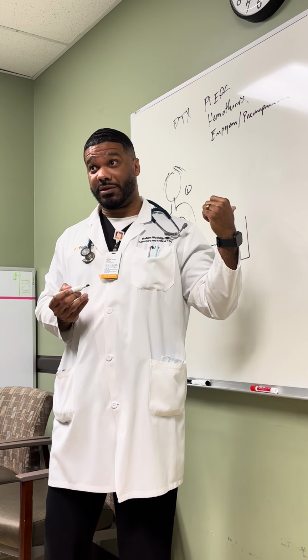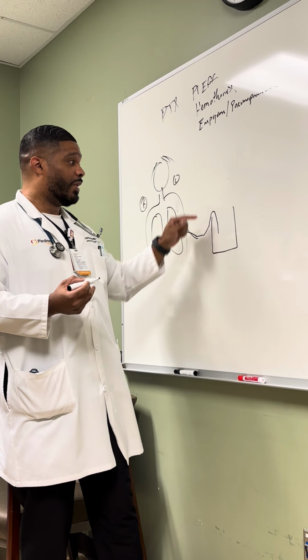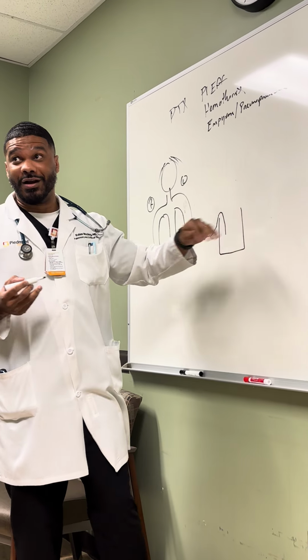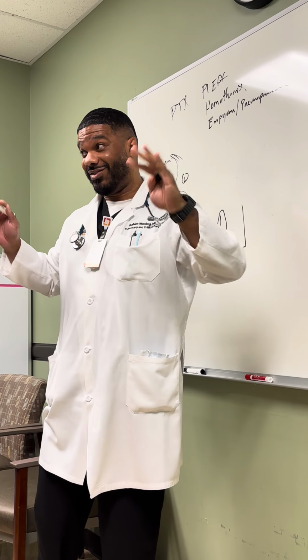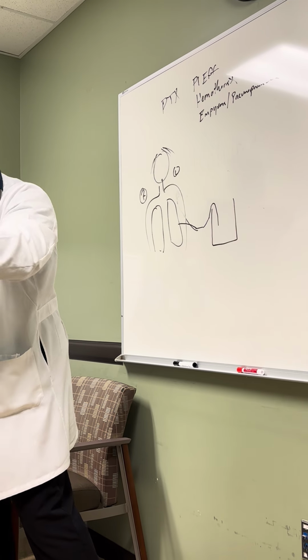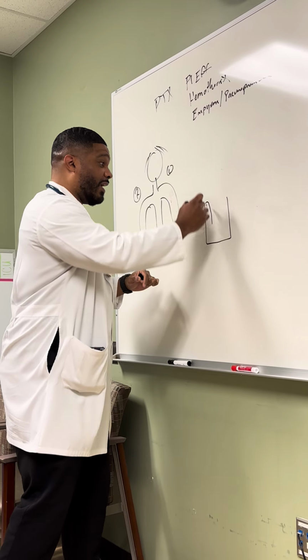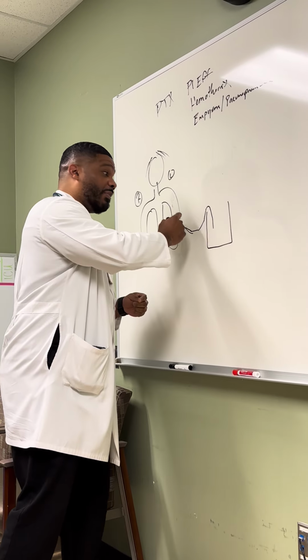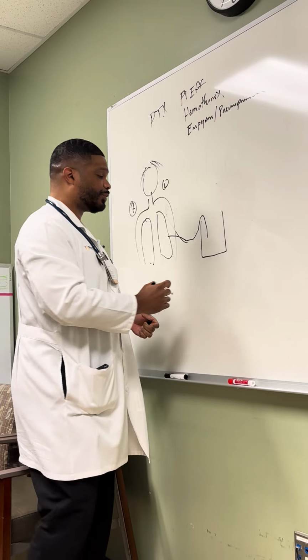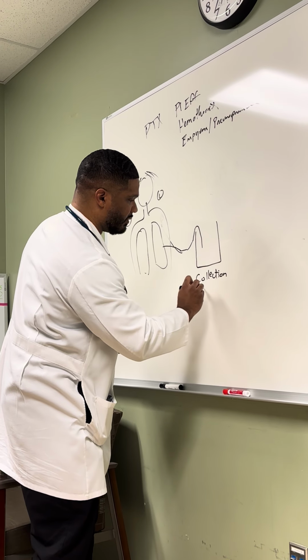Can anybody think about some potential complications from just taking a chest tube and putting the other end into an open container out in the open, not contained or anything like that? Infection, or gravity, infection. And what about if there's an opening, clotting, and then air coming back into the system, right? So not ideal, right? So this was a collection bottle.